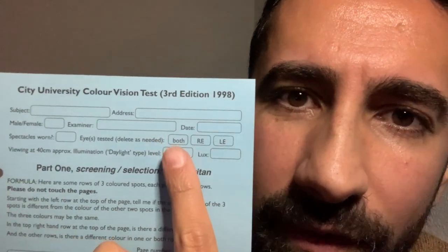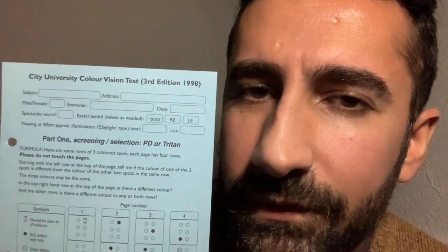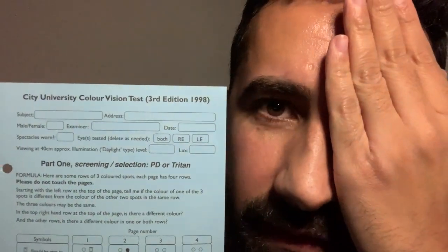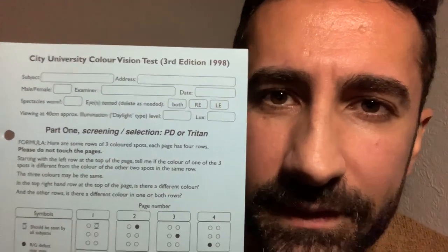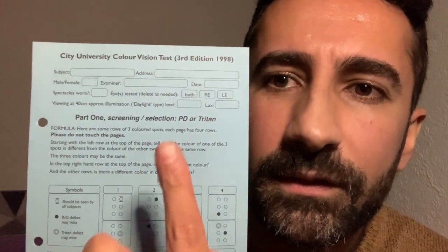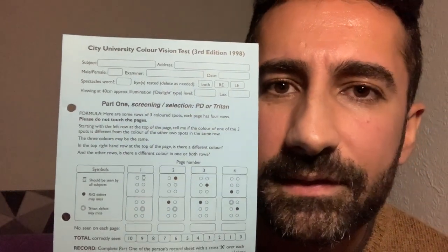The most important part is stating whether we've done the test with both eyes open, right, or left. If we're thinking about whether somebody has an acquired colour defect — one they're not born with — we'd have to perform the test monocularly through just one eye, checking the right and left separately, because an acquired colour defect may vary between the eyes. For a congenital colour defect, which means you were born with it, we can perform the test with both eyes open, as it will affect each eye the same.